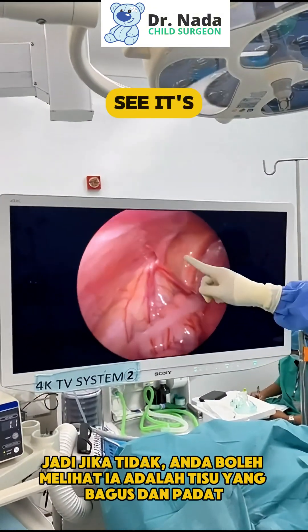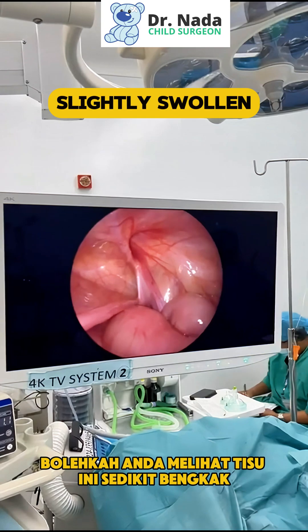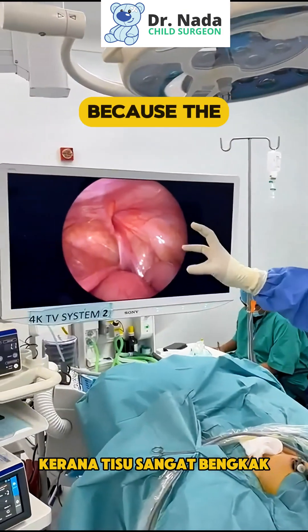Otherwise, you can see it's nice and firm tissue on the normal side. This one is a bit swollen — you see this tissue is swollen because he had a hernia stuck. If you did an open surgery for this one, it would be very difficult because the tissues are very swollen.